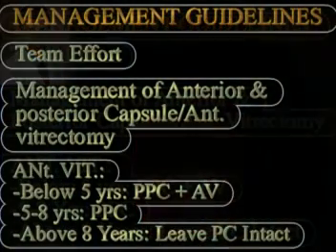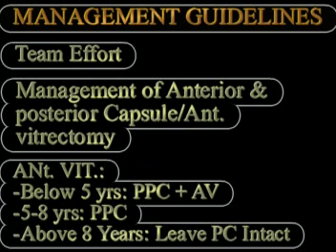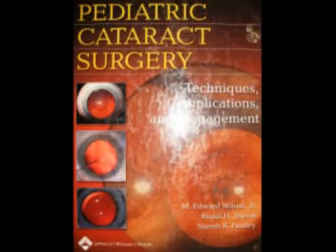So to summarize, management of infantile cataracts is a team effort and needs special efforts on the part of the ophthalmologist and the entire team. Management of the anterior and posterior capsule is important depending on the age of the child, and we recommend this textbook on pediatric cataract surgery for this purpose.